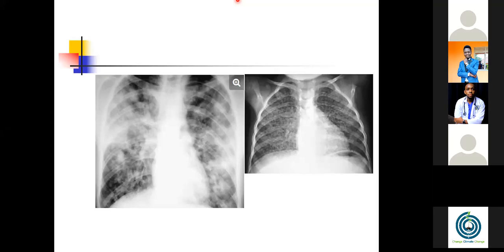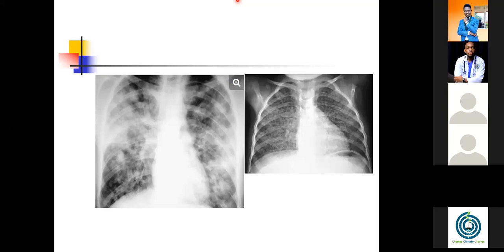Yes, thank you. When we interpret some of these images, we take into consideration the clinical history as well. So what you have said is absolutely right, that it can also pass for metastasis.